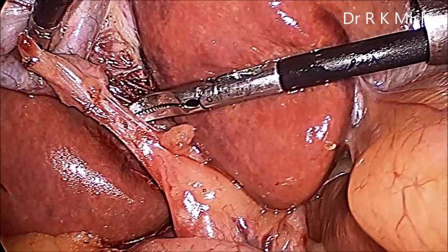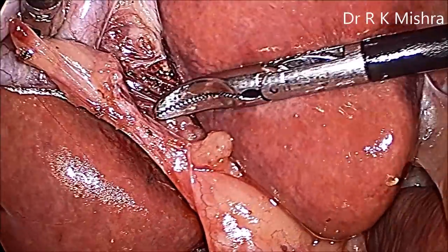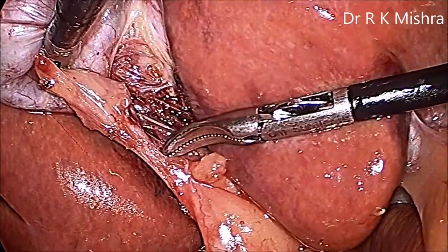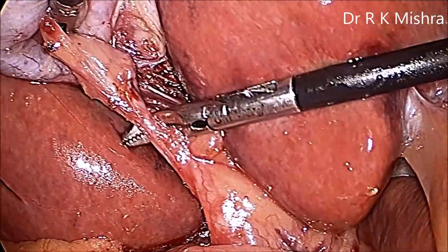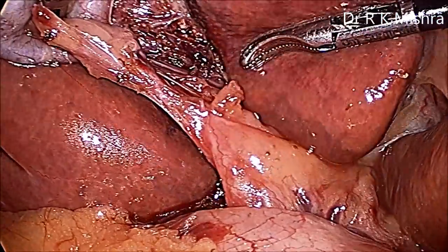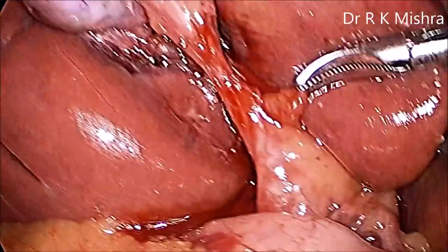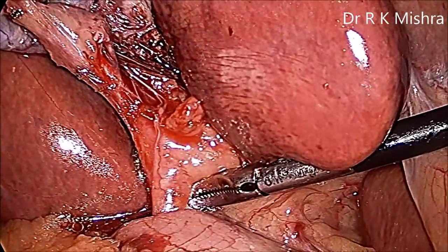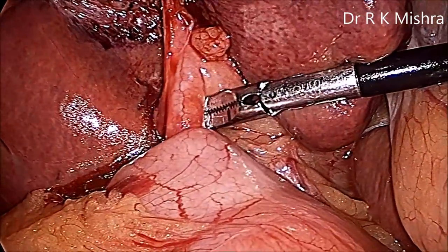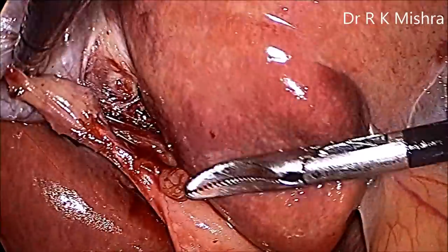These are the small fibrous trabeculae and adventitious tissue which you can break. This is the cystic duct, this is the cystic artery — a nice window is formed. But beginners sometimes make the mistake of over-tenting, going much lower and damaging the CBD. The CBD is below; there should be a nipple effect — once you release it, it should spring back erect, meaning it is the cystic duct. If you accidentally hook the CBD, you will definitely cause a CBD injury. Always remain in the correct plane.